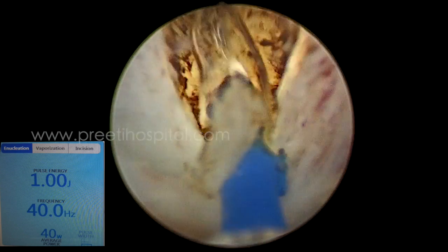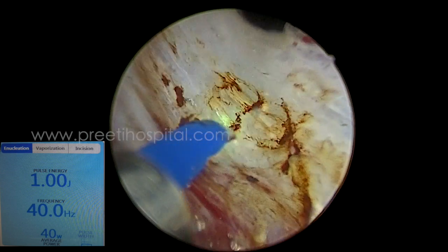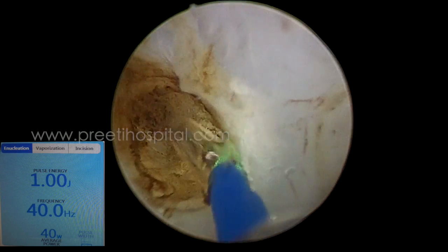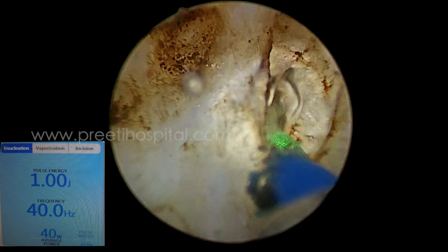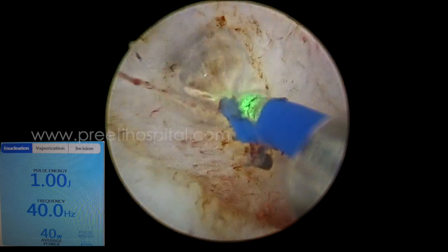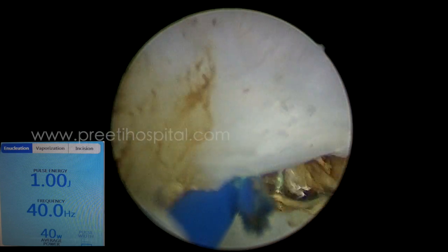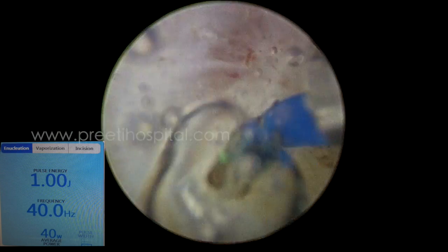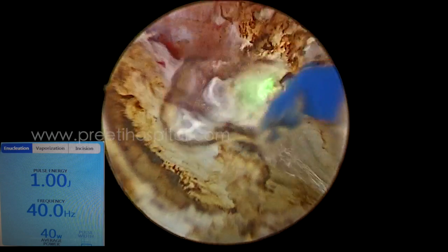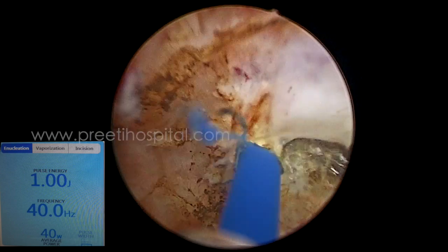In this case, we repeatedly did not inspect inside the bladder, which resulted in going very closely to the ureteric orifices. This is the 6 o'clock position. The surgery otherwise went well, except on the right side where a little bit of plane was lost. From the bladder neck, an inverted or hockey incision is given, but we were not looking into the bladder — we were continuously working at the base only, going reverse and forward.